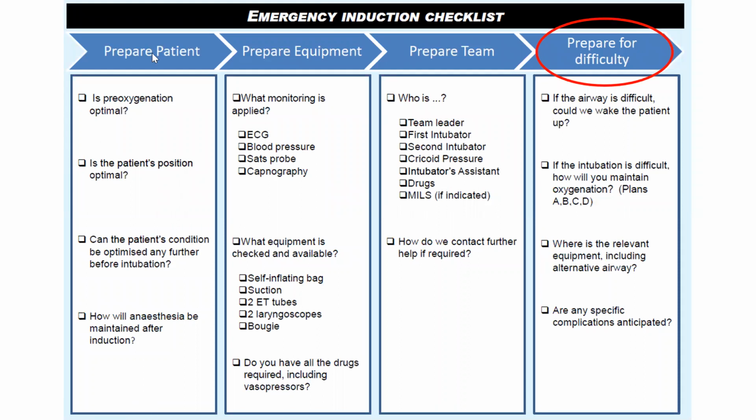In preparation, or when we're thinking about intubating a patient, we should always move through an emergency checklist or a methodical approach. We need to make sure our patient is being prepared, our equipment is being prepared, our team is ready, and also prepare for difficulty.